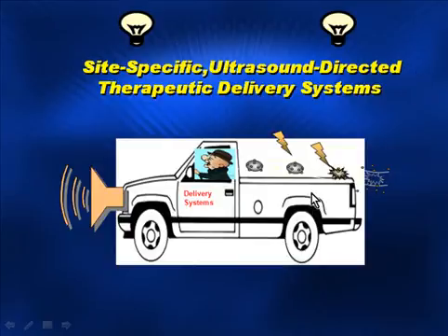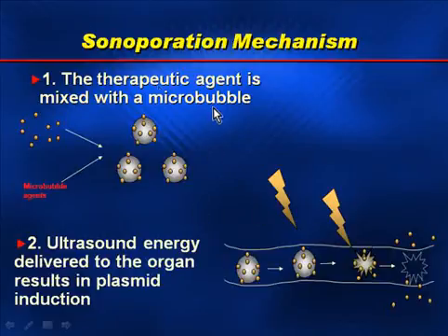The microspheres carry agents, and with the activation of ultrasound will deliver at certain locations their payloads. A simple slide demonstrates the agent is mixed with the microbubble, and the ultrasound energy then destroys the microbubbles and delivers the agent at sites.